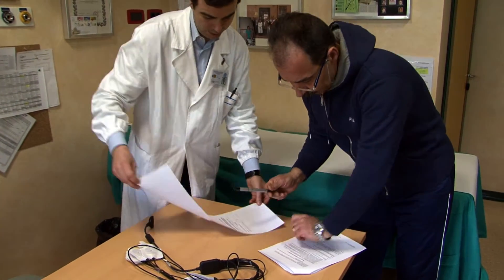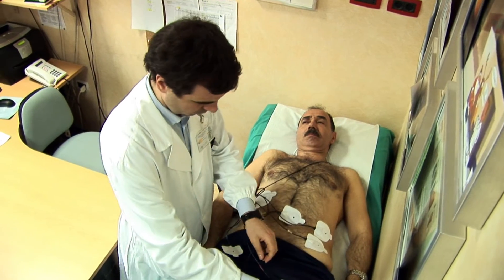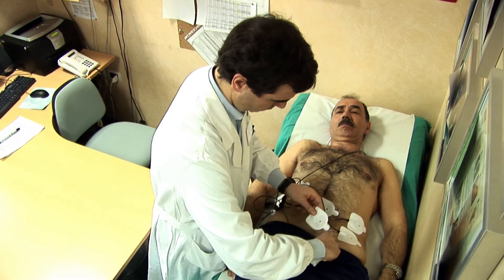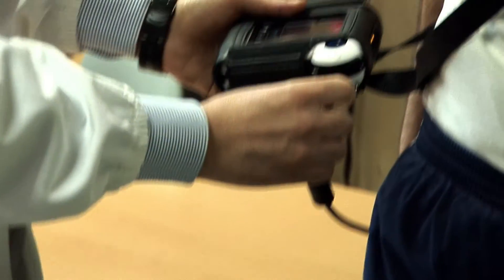When they arrive, we prepare the patient — that means we check the patient into the workstation and we wear the patient with antennas that we place on the abdomen of the patient.